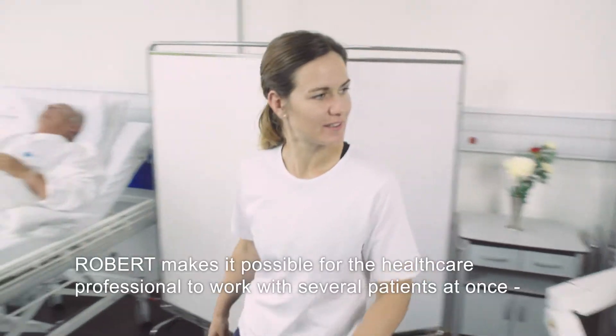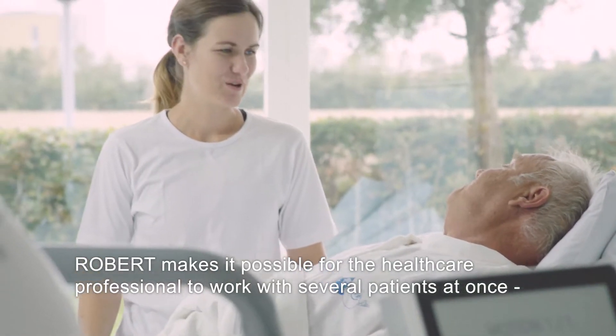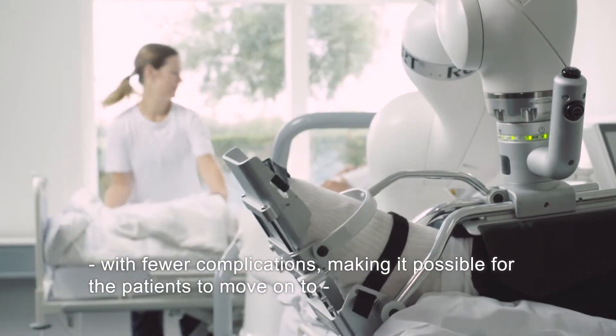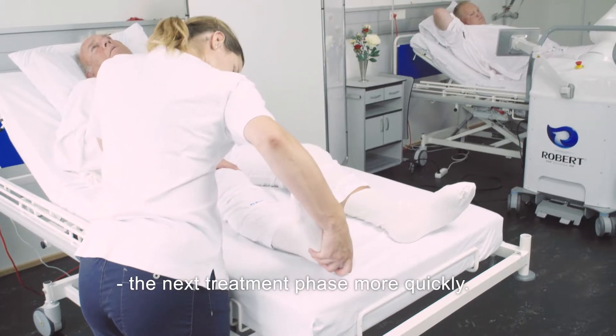Robert makes it possible for the healthcare professional to work with several patients at once. Robert takes part in a more efficient and comprehensive rehabilitation with fewer complications, making it possible for the patients to move on to the next treatment phase more quickly.